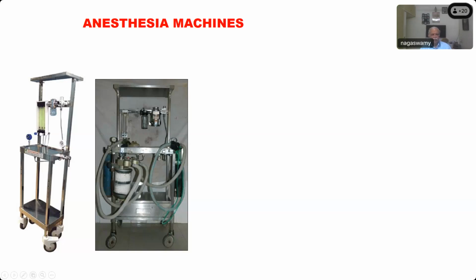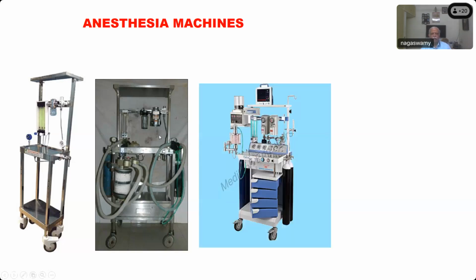So this was a slightly advanced version of the older model, because here when you have only 1 cylinder and halfway through you run out of oxygen, what will happen to the patient? Hypoxia. He will die of hypoxia. So they thought of that, or had an accident like that, and then they stuck to the rule that you should have 2 cylinders, 1 in use and 1 spare, and that is the reason why another cylinder was added. Okay, so this is the next model.